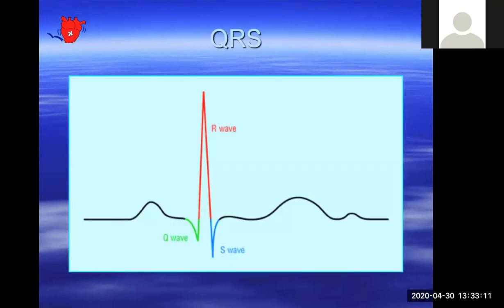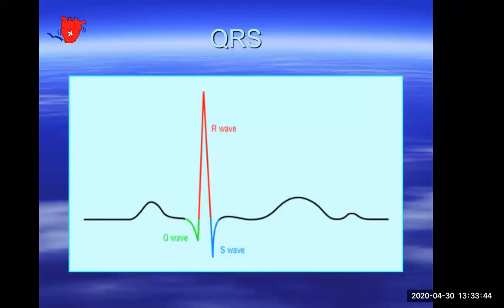What about the QRS complexes? The QRS complex is, as I said before, the depolarization of the ventricle. If you look at our ideal lead, which is lead two, in line with the heart, looking at the heart from the bottom, initially you see a tiny, very small Q wave, because the ventricular septum is stimulated from the left to the right. So it just appears to go away initially, giving that small flick, the Q wave. But then it goes all the way through the Purkinje system to depolarize the ventricle downwards, so it becomes a big positive R wave.